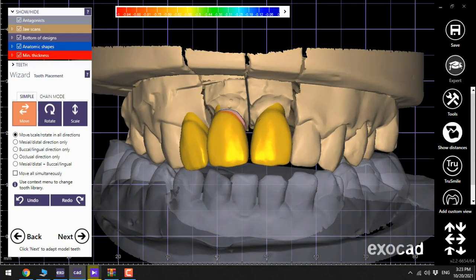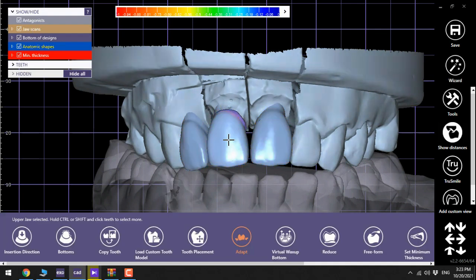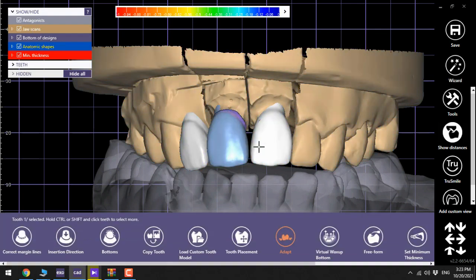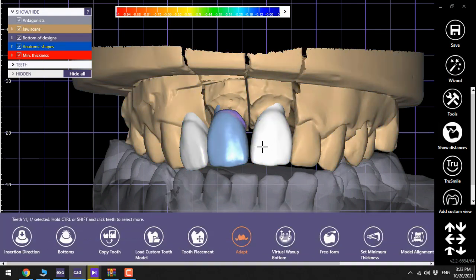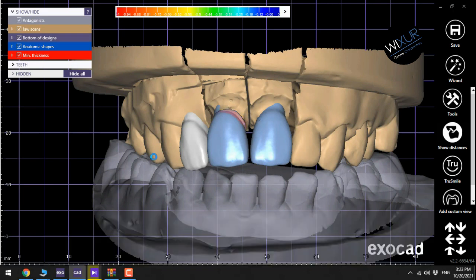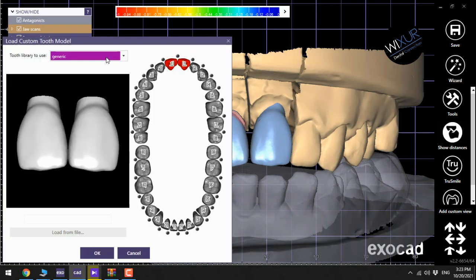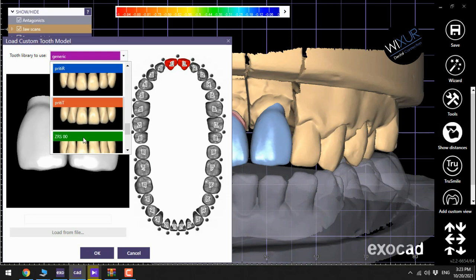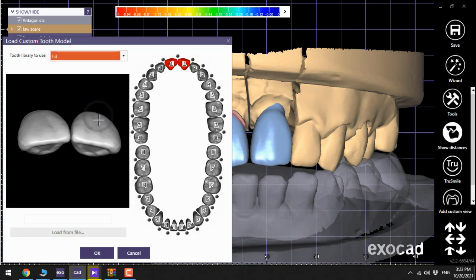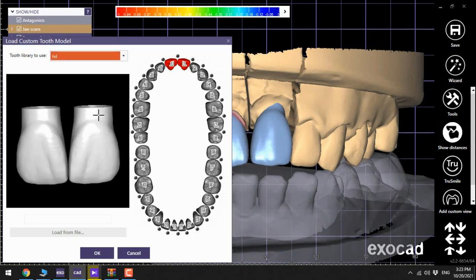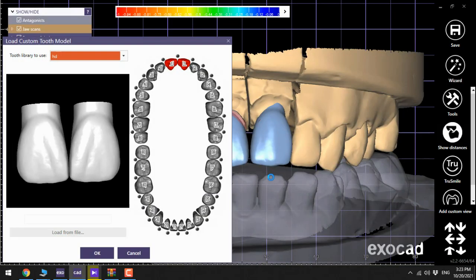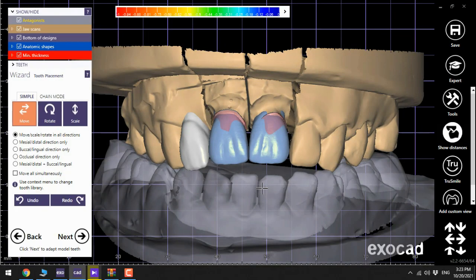Go to the expert mode then click on the teeth and now here load custom tooth model. I choose the HD one in this case. Then click OK. Yes. And go back to the wizard mode.